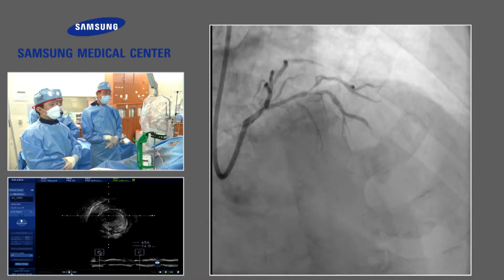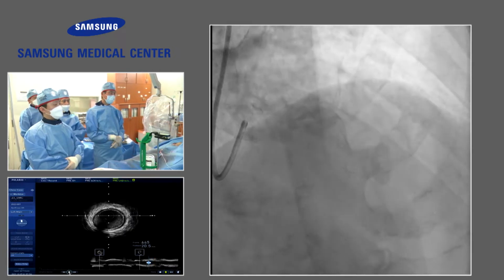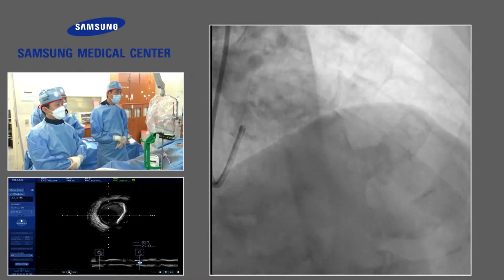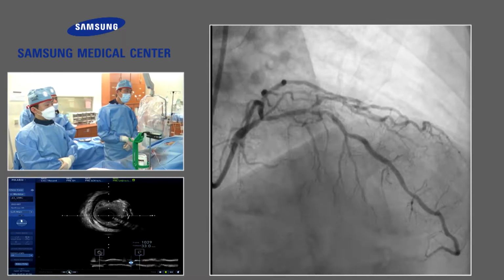Do I have to say now? My strategy is just to stent from left main to mid LAD, then see the circumflex and diagonal, do ballooning, see the angio, and final kissing balloon and finish. Or the side branch may be treated with DB. So what's your plan?